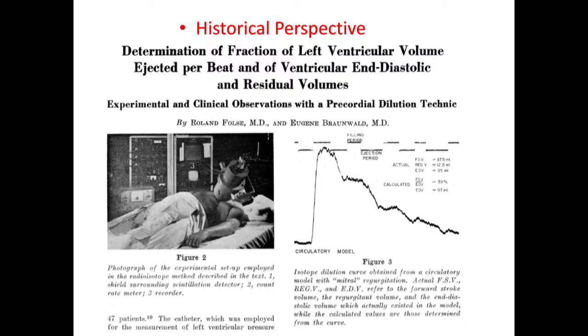Look at the title. I think back then ejection fraction as a term wasn't even invented, so it was called fraction of LV volume ejected per beat, ventricular end-diastolic and residual volume. Obviously right now we call it LVEF, LVEDV, and LV end-systolic volume. But this is probably more accurate because for residual volume, we don't always get the end systolic. So anyway, just a historical note.